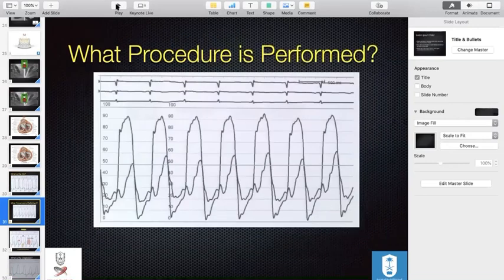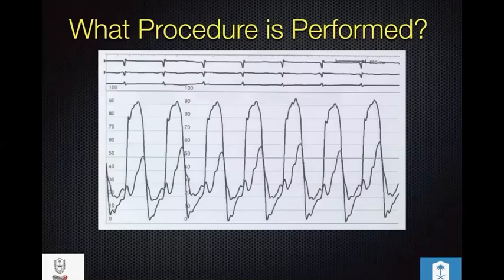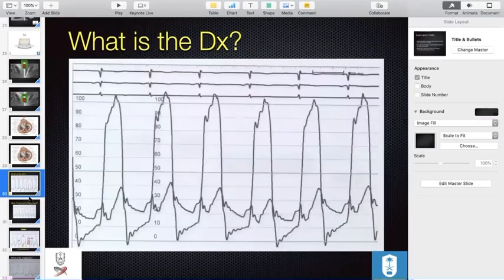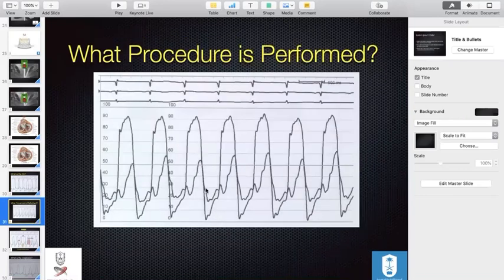So then you see this. What procedure was performed here? You see the gradient came lower compared, but something bad happened. Look what happened. The V wave becomes so large and so high. When we call a V wave ventricularized waveform, this is what we call a ventricularized waveform, because it's starting to become in the ventricular territory, which is the ST-T segment. And this is a sign of severe mitral regurgitation.